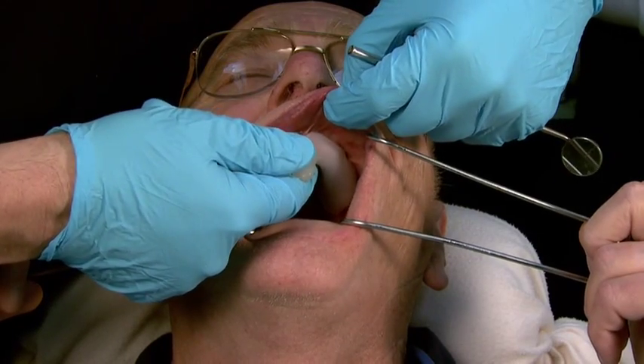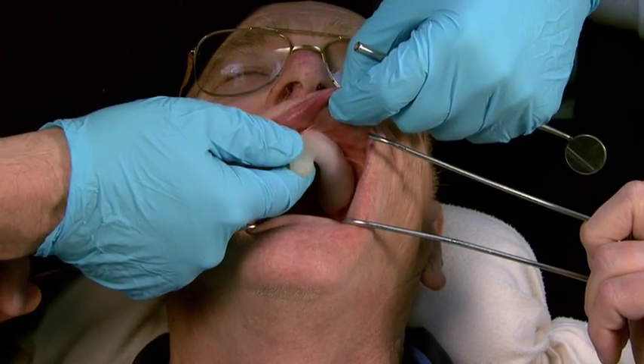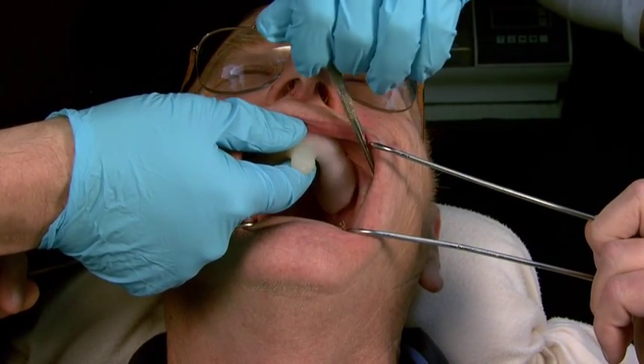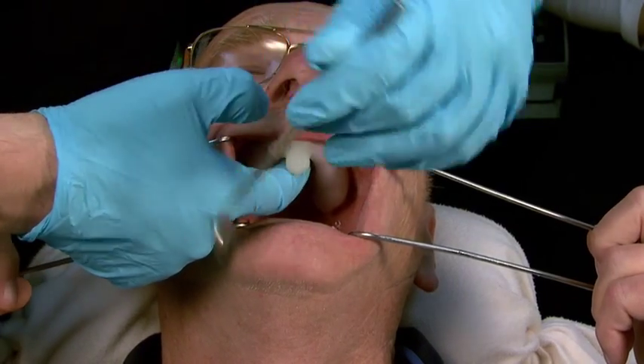I'm first going to evaluate the anterior left and the anterior left is satisfactory. The left frenum requires relief and now I'm going to check the posterior area. The posterior region is satisfactory, so the left frenum requires relief.